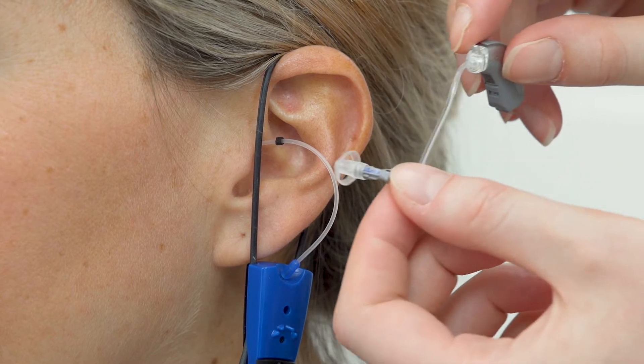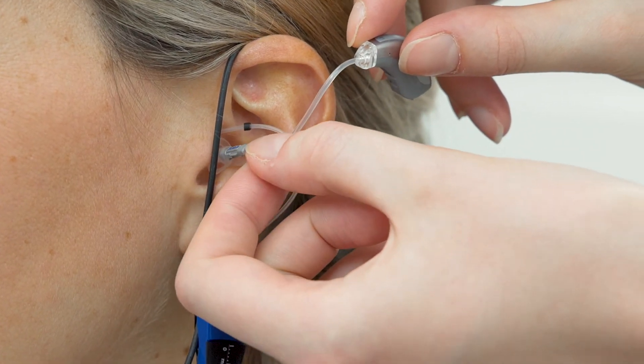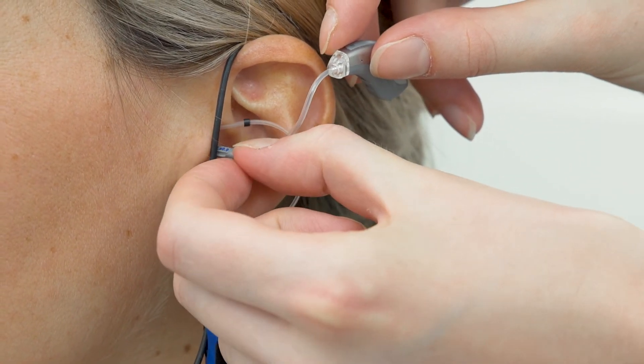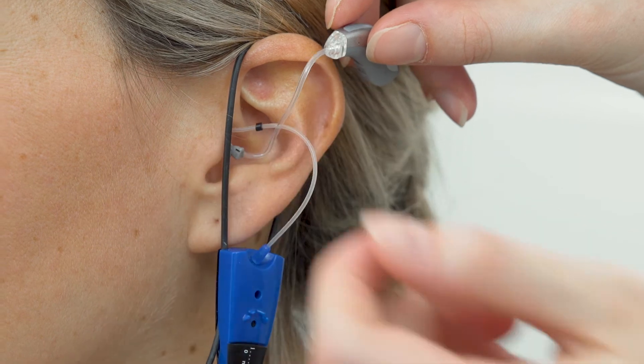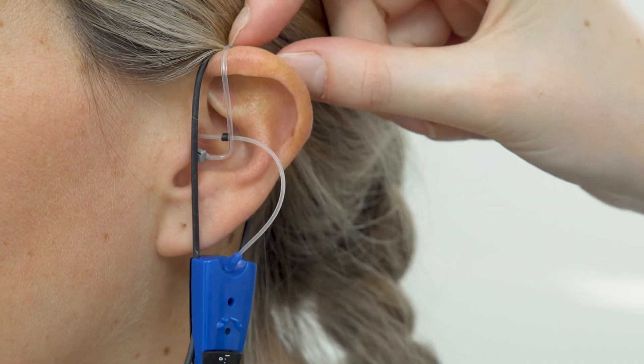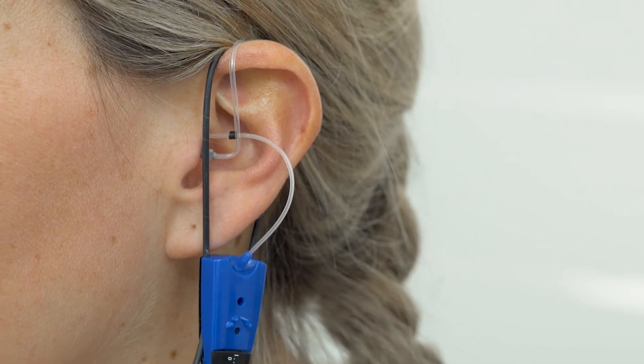In the case of occluded measurement, the patient should wear the hearing aid but turned off. The probe tubes should be inserted in the ear canal reaching a few millimeters distance from the eardrum so that we can measure the occlusion effect due to hearing aid insertion.